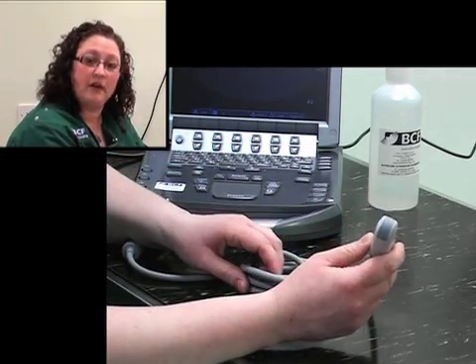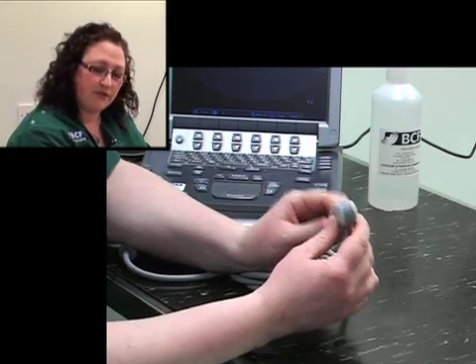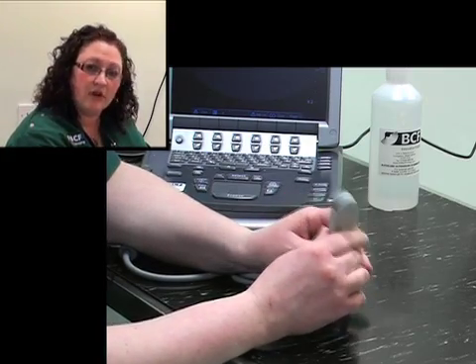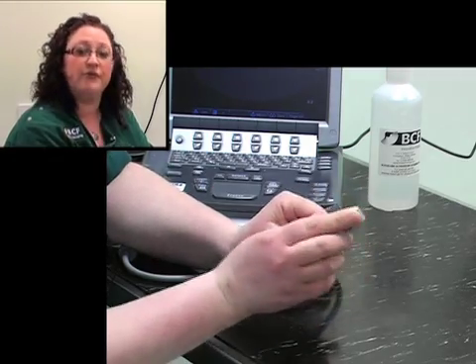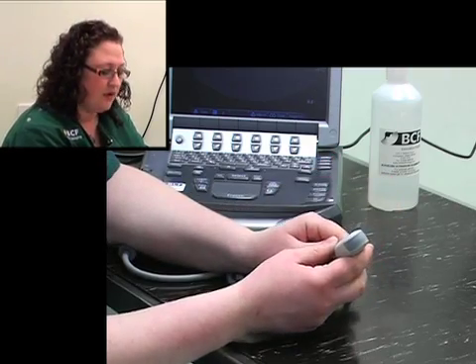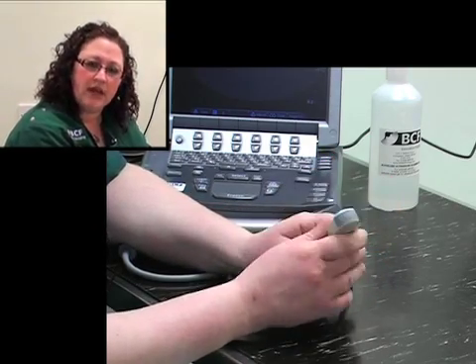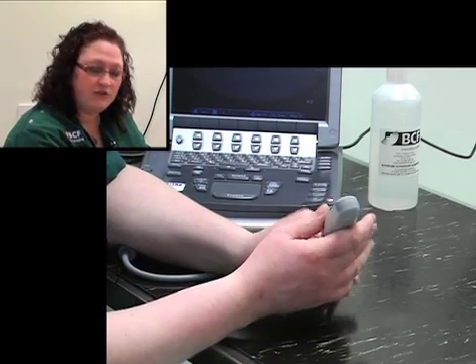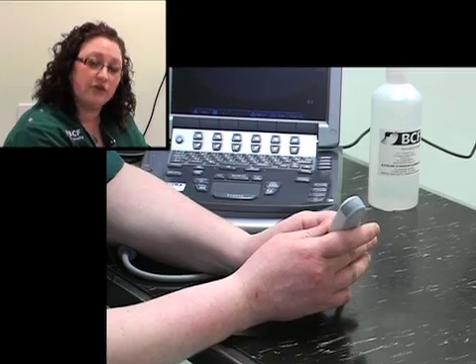First off, for this type of examination, we will be using a curvilinear probe. This particular type is a microconvex probe. What's quite good about this is it has quite a small footprint, which is the scanning surface of the probe, also called the transducer. What's good about having a small footprint is that you're able to really get up underneath, say, the rib cage to be able to get a really good image of a structure such as the liver.